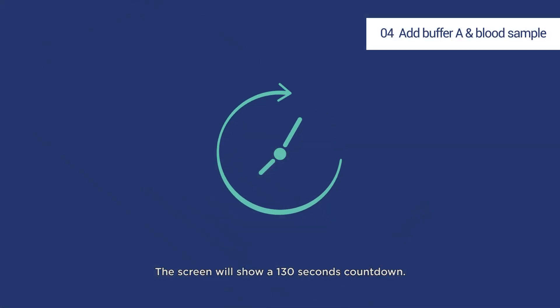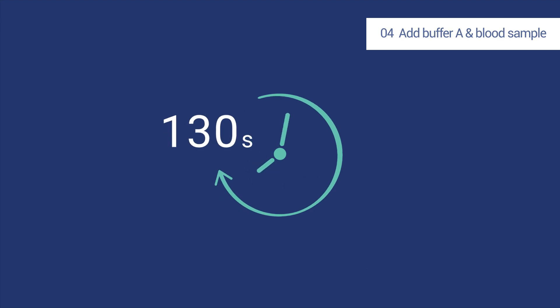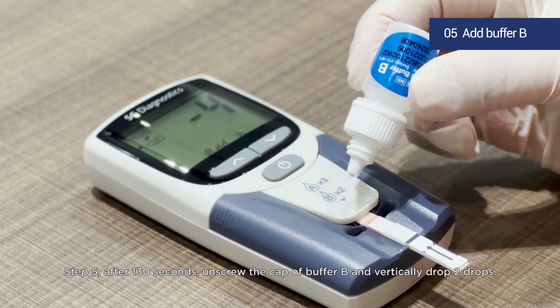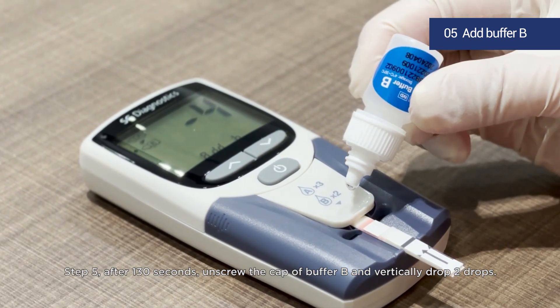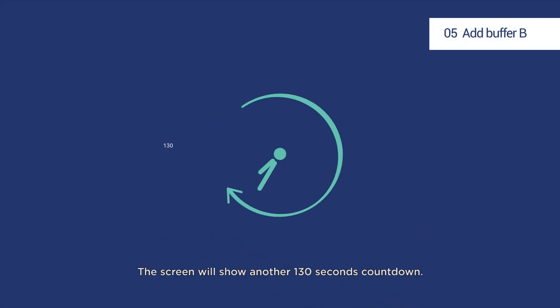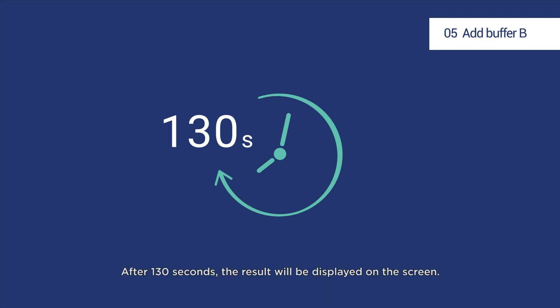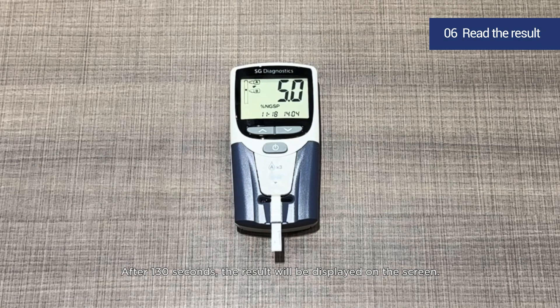The screen will show a 130-second countdown. Step 5: After 130 seconds, unscrew the cap of buffer B and vertically drop 2 drops. The screen will show another 130-second countdown. After 130 seconds, the result will be displayed on the screen.